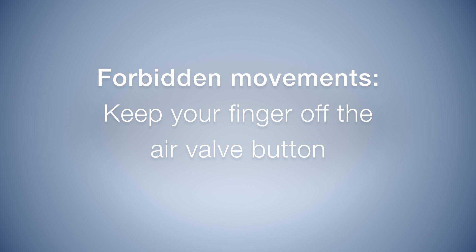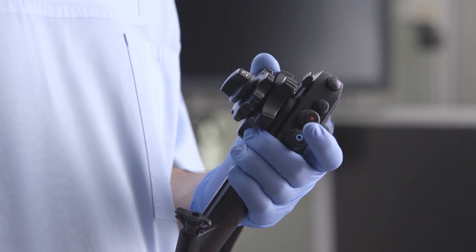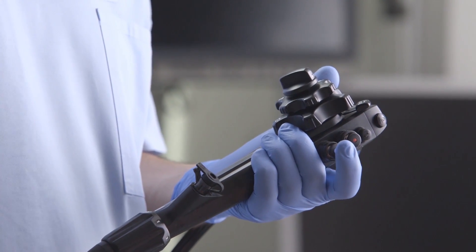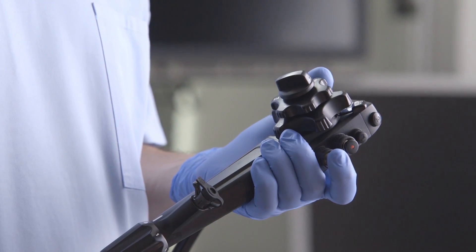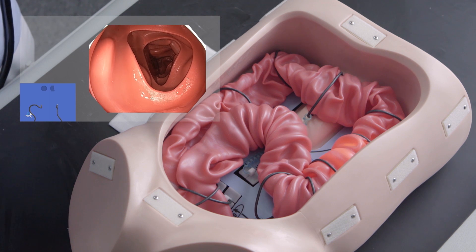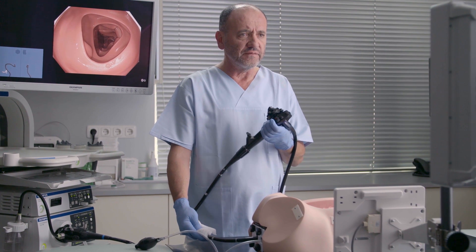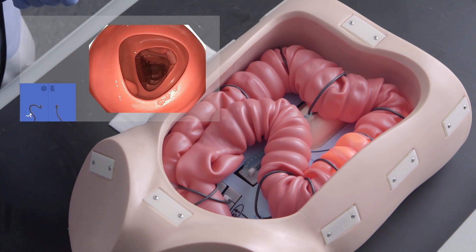Let's move on to forbidden movements. One common problem in colonoscopy is the air issue. The air button is easily available, so it's quite easy to get into it and just hold the fingertip on it. You want to have a good view of the lumen, so you just blow air to continue — you want an almost clear view of the colon — but by doing this, you get into trouble.